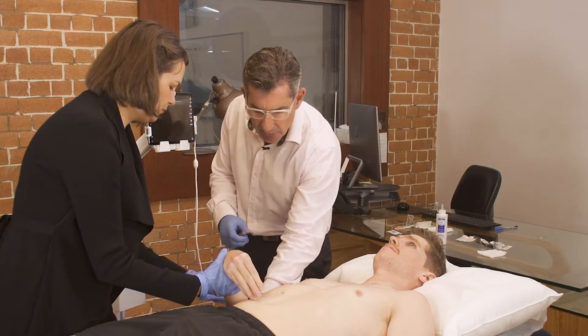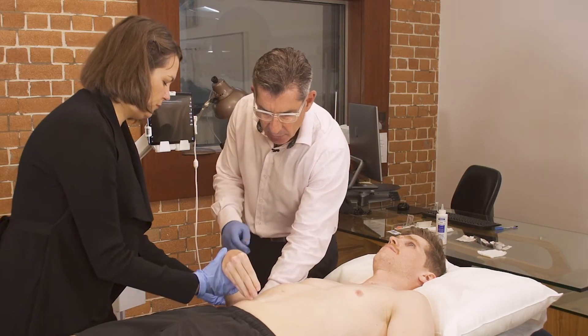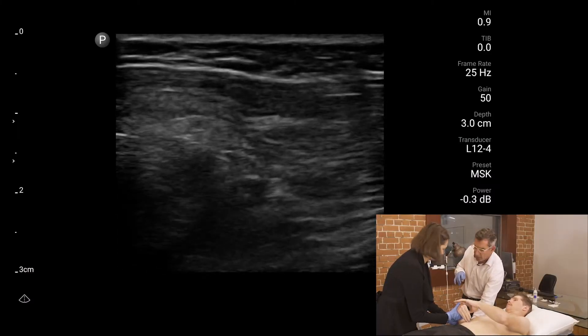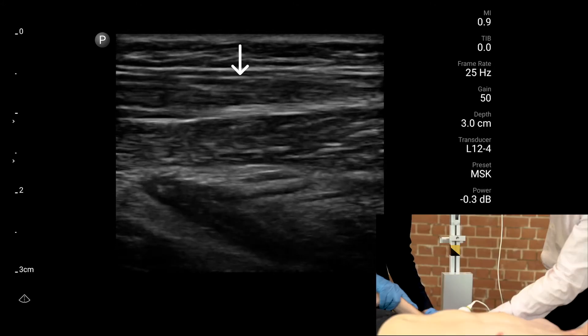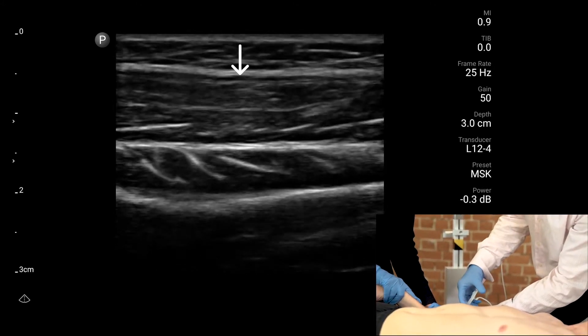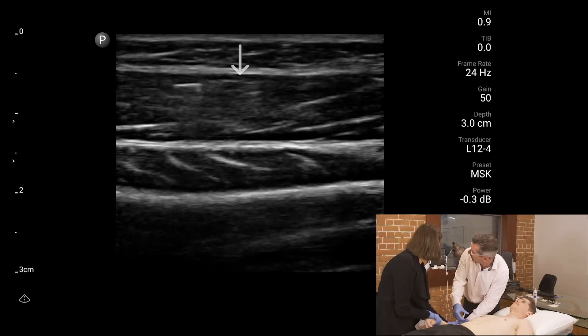Brachioradialis — just palpated between your fingers first to ensure you're in the right spot. And there it is in the centre of the screen. This is the muscle here in the centre of the screen. Scratch. There's the tip of the needle.